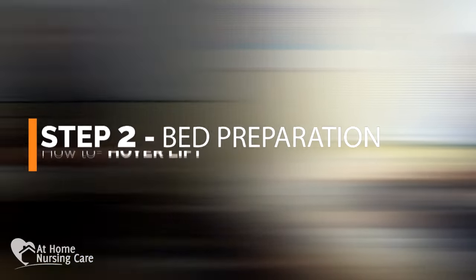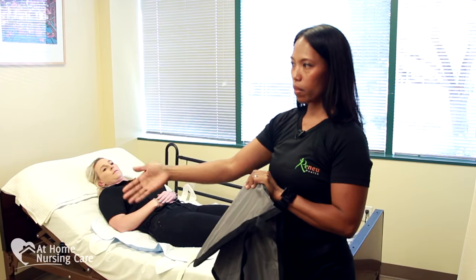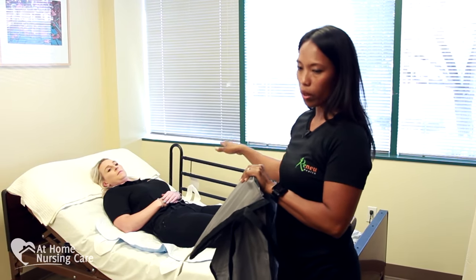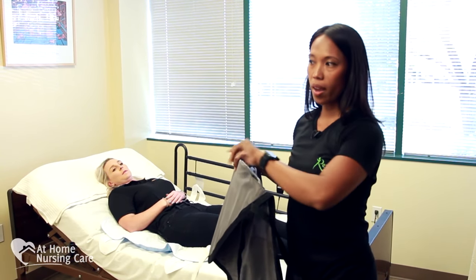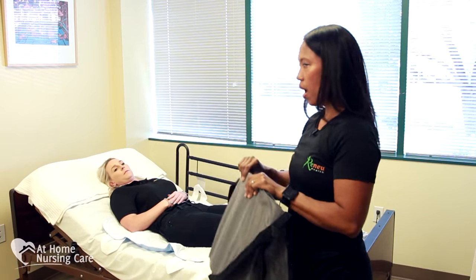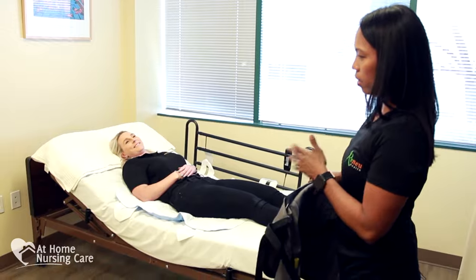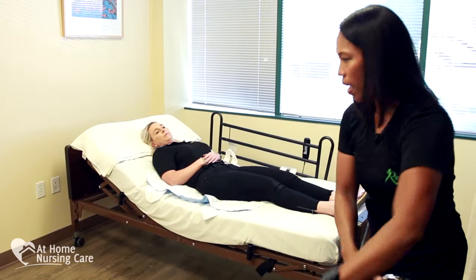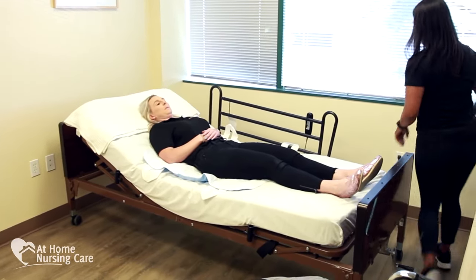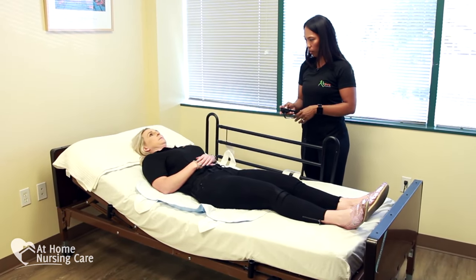For preparation, we want to make sure that we have all of our equipment ready before starting. I have the sling, I have the Hoyer Lift ready to go facing the bed, and the wheelchair is close by but not obstructing the path where I'm moving the Hoyer Lift. Looking at the bed, Kathleen looks relaxed, but it's not an optimal position to start the transfer. For the bed, we should have it at the most flat portion, so we lower the headrest to make it flat.